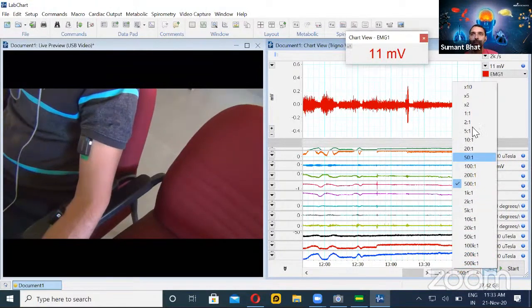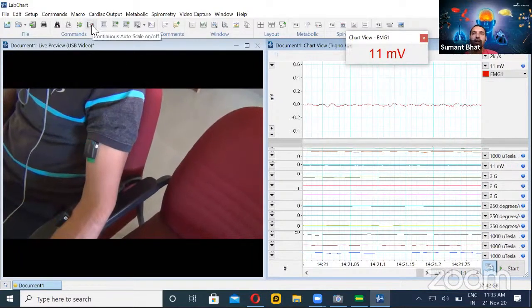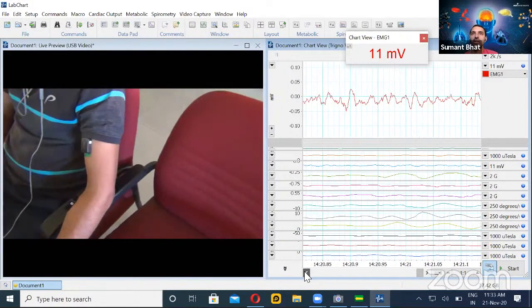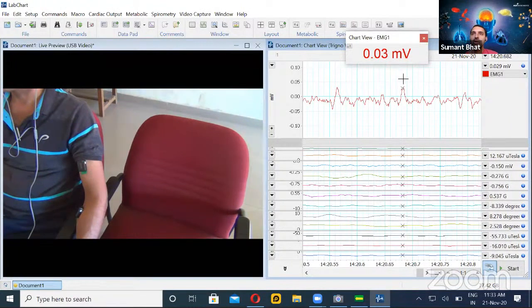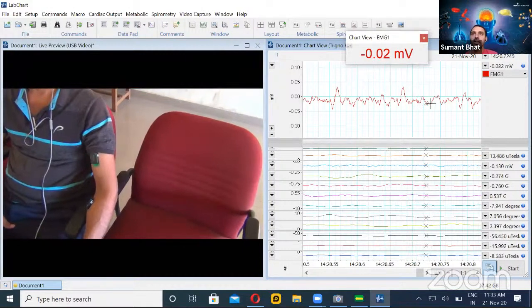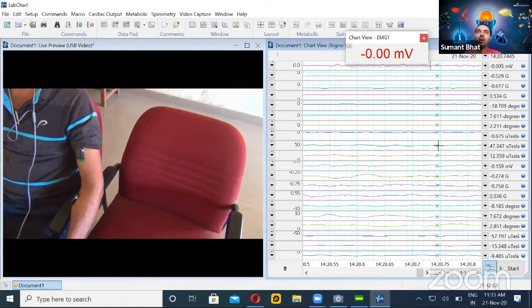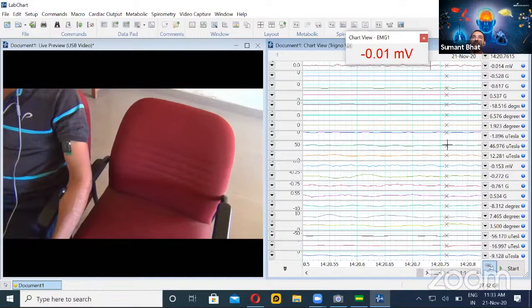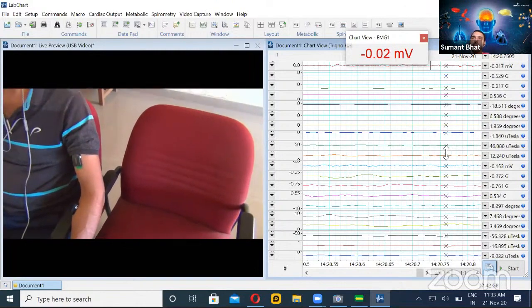I can also zoom in for a much more fine-tuned or expanded waveform, keeping it in continuous autoscale mode to see changes. The moment I take the cursor to the peak, it shows the value at that point is 0.03 millivolts, and as I move the cursor, it instantaneously shows the current value. The other channels will show in different units: the accelerometer shows in Gs, gyro in degrees per second, and the magnetometer in microteslas.